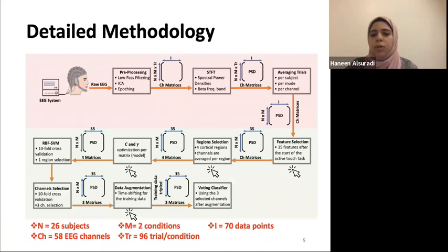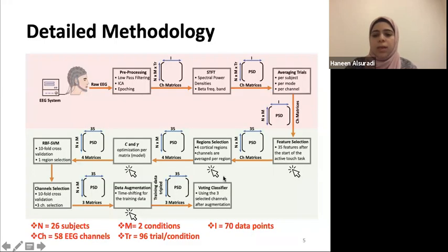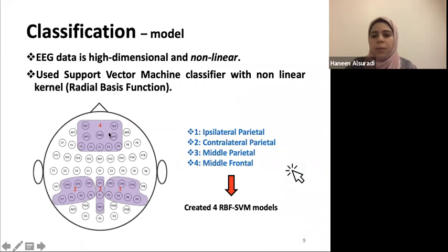This block diagram shows the implementation of the pre-processing steps highlighted in red and the classification steps highlighted in green. Once data is pre-processed, we feed the data to the classifier block. We start with the feature selection, which is simply dropping the EEG activity before the onset of the experiment, simply because it doesn't help in classification. Then we selected 4 brain regions and averaged the activity per region. In the figure, you can see that frontal and somatosensory regions are selected.